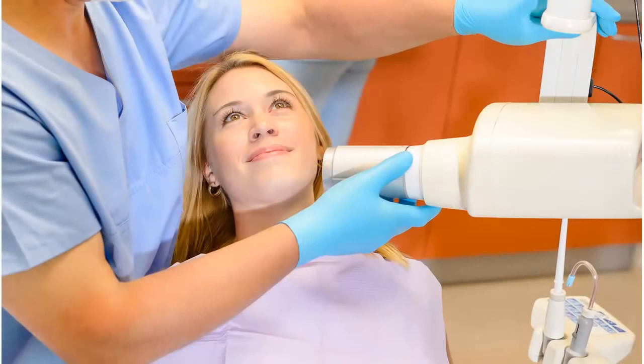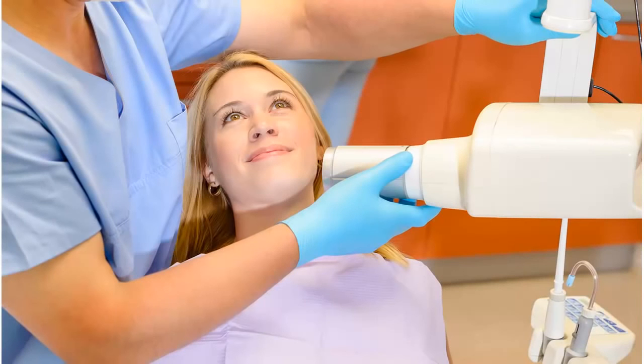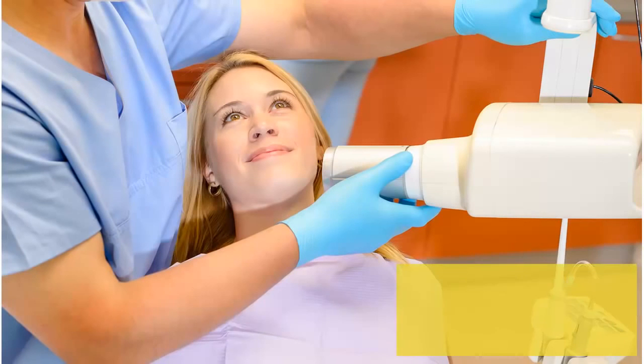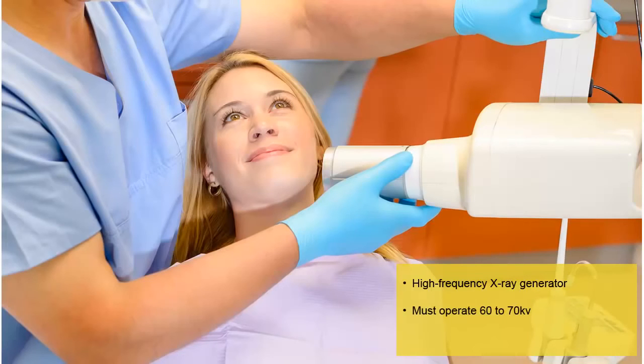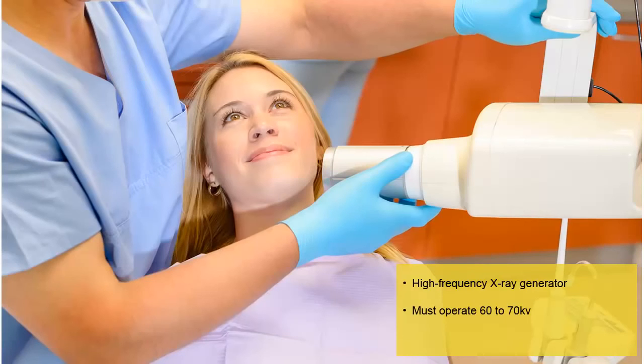The RVG sensor is compatible with all x-ray generators that meet the current standards of intraoral radiology. We recommend a high-frequency x-ray generator so that the patient is exposed to a lower dose of radiation. The x-ray generator must operate with a voltage of 60 to 70 kV. The RVG sensor is not compatible with generators that have a voltage less than 60 kV.